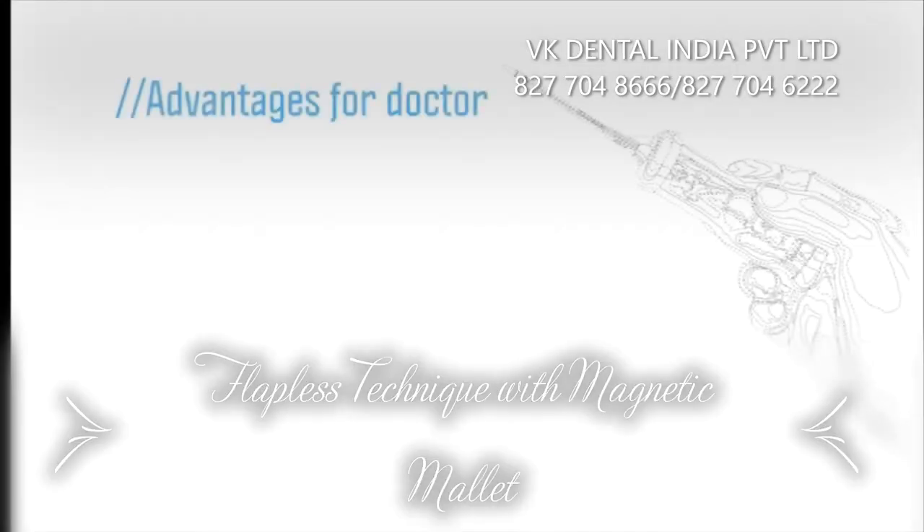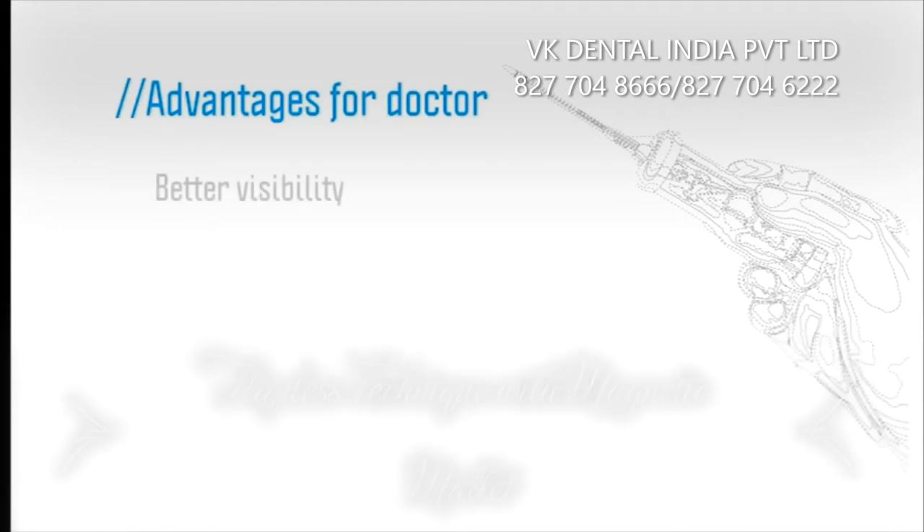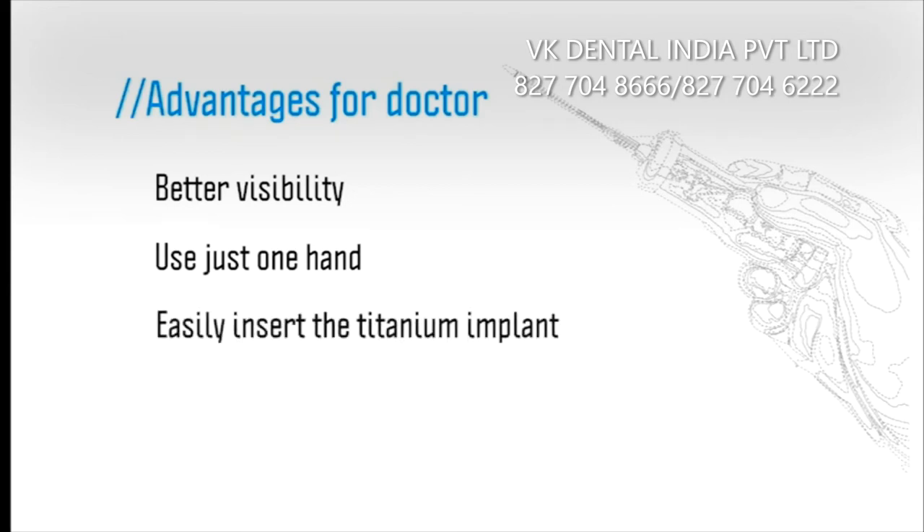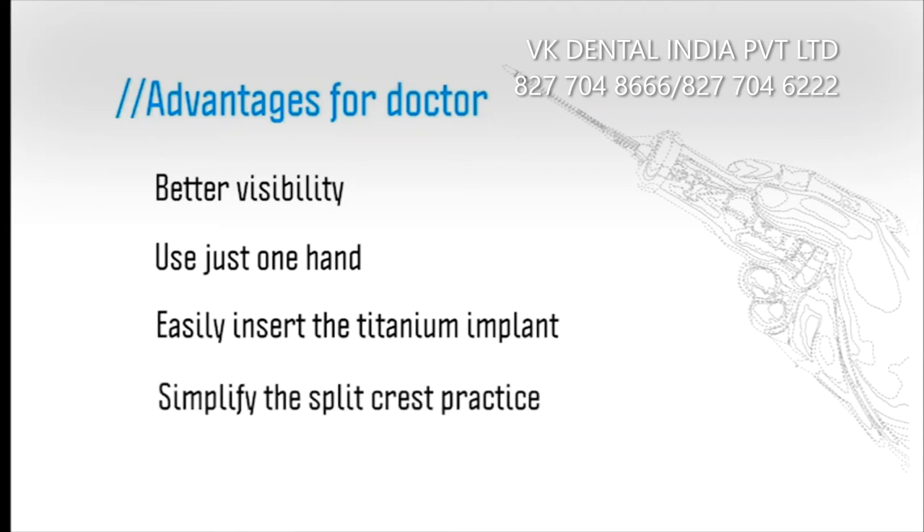Using Magnetic Mallet, the doctor has better visibility in the surgery practice using just one hand for both handpiece and osteotome. They can easily insert the implant thanks to the specific implant housing, and improve and simplify the split crest thanks to the special cutter.